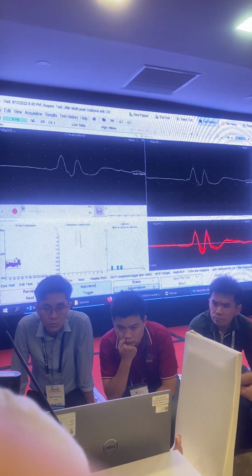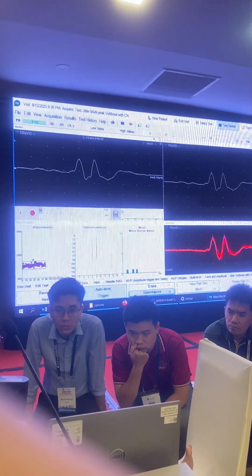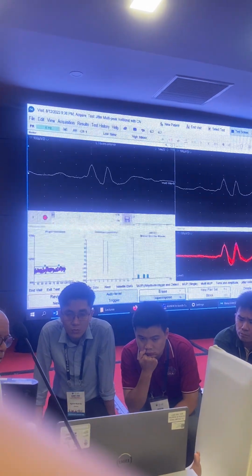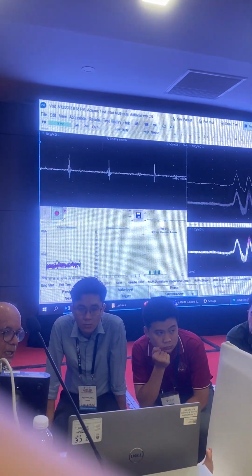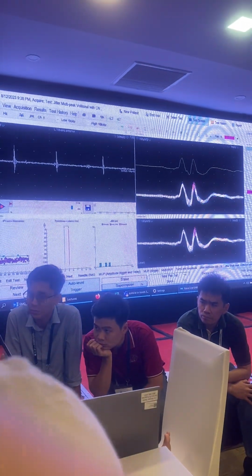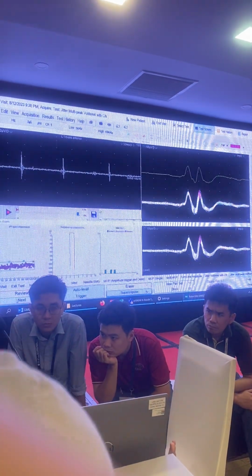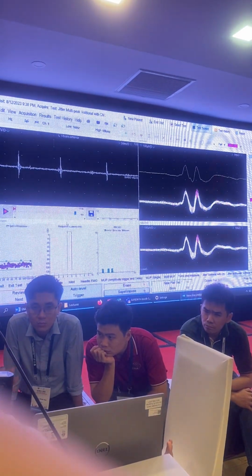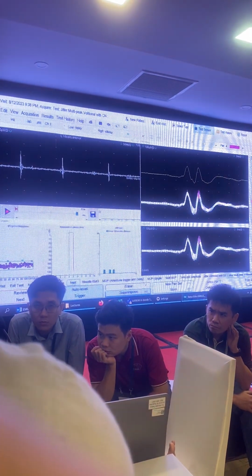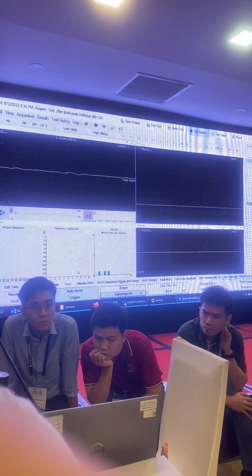So the machine is trying to detect the peaks automatically. It's updating the jitter over here, 26. This is all normal. This all looks normal to me. I stop. But to do fully automated analysis, I suggest that you practice with manual things about how you enter. Once you get comfortable, then you can do it. I will do one more site, and then let's see who wants to do the patient, okay?